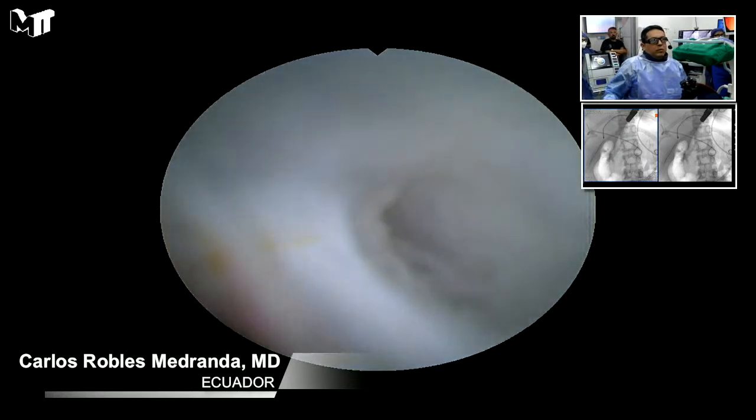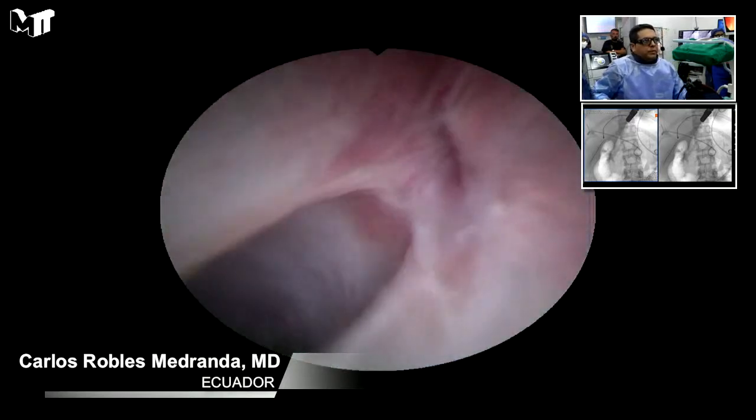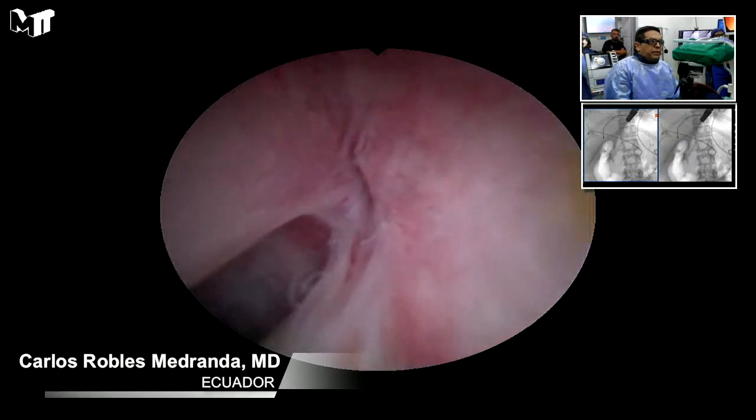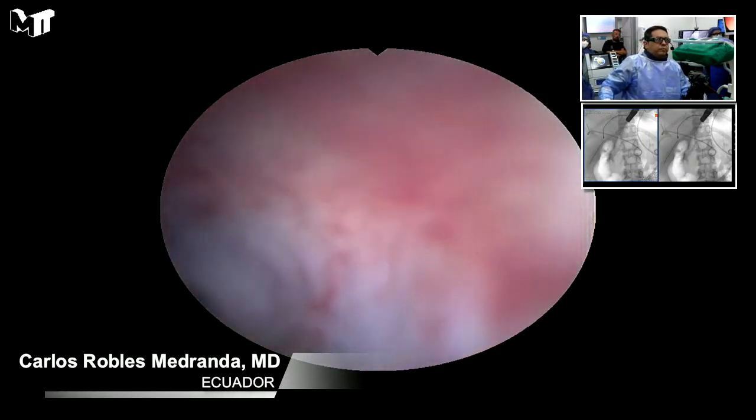I'm trying to see what is this. I'm trying to figure out what is this. Están aquí.